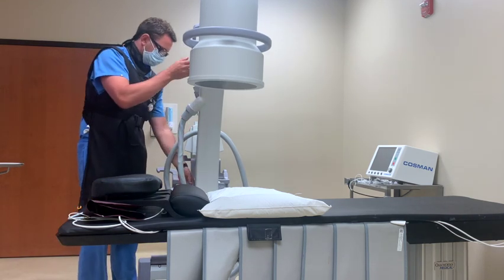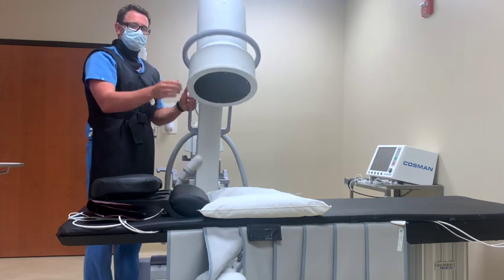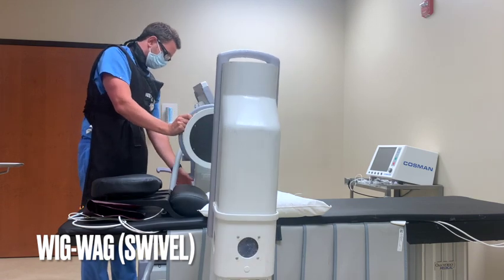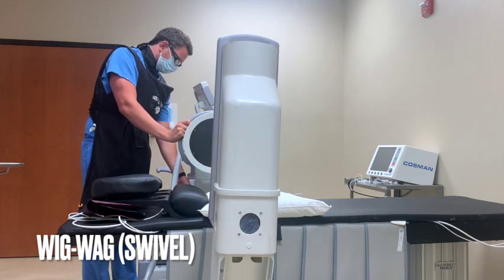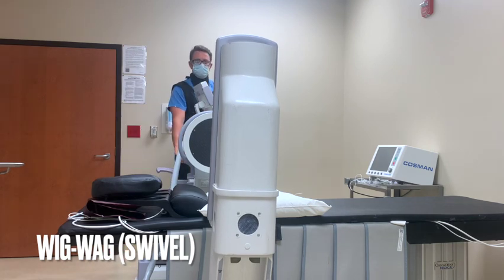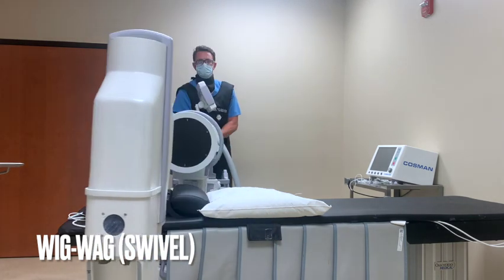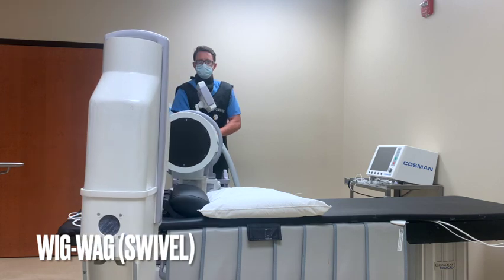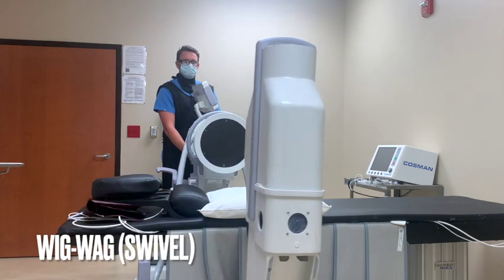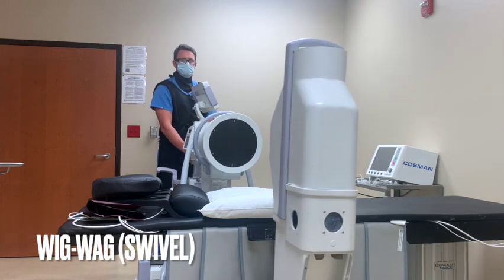Lastly, we will display the wig-wag or swivel. This involves the use of a third plane of axis. Typically, this is used while the C-arm is in a lateral position, with the C-arm's image intensifier rotating inferiorly and the source rotating superiorly, or vice versa — essentially rotating the C-arm clockwise or counterclockwise around the patient. It is also worth noting that these traditional moves can be and often are combined to optimize the image.